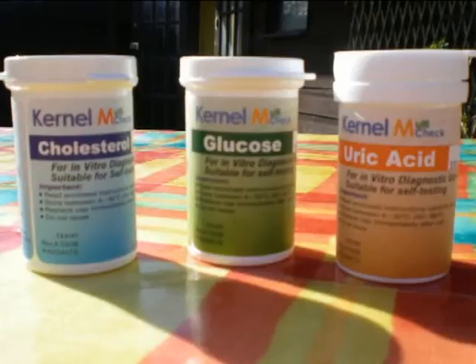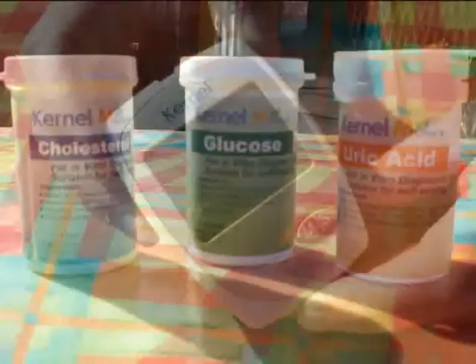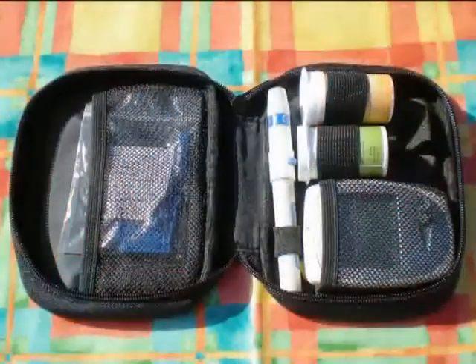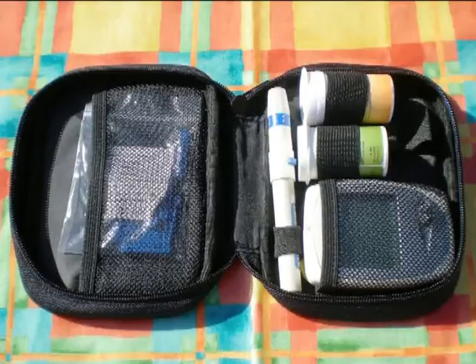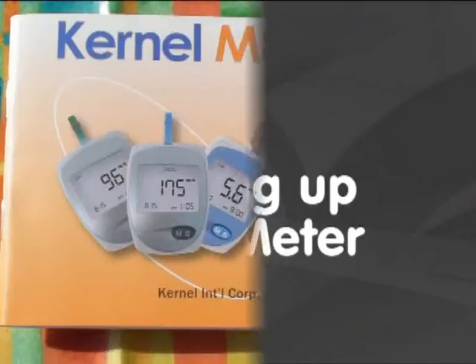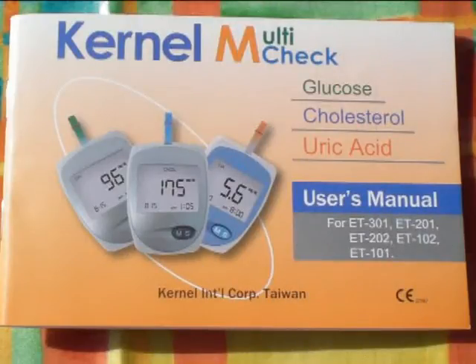These are all colour-coded on both the test strips and chip. You will also receive your meter and batteries. The meter is easy to use but can be daunting at first. Once you have used it a few times, it becomes easy. Before starting, please ensure you read the instruction book thoroughly.